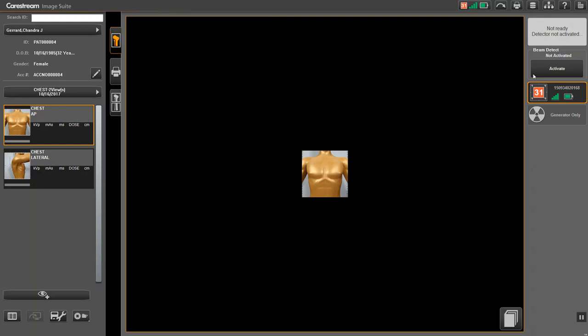Click on the Activate button. Once this is clicked, you have 2 minutes to take the exposure. A countdown timer will be displayed. When ready, click the Exposure button to take your exposure.